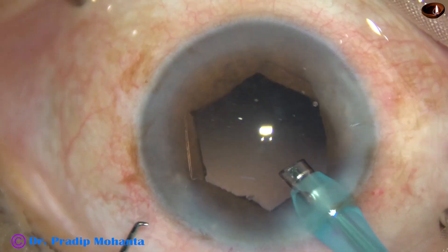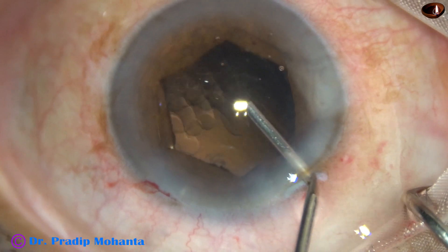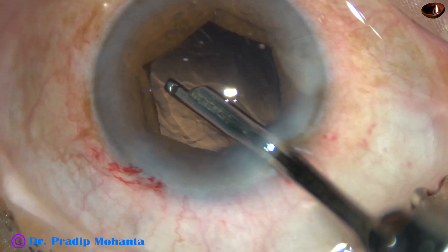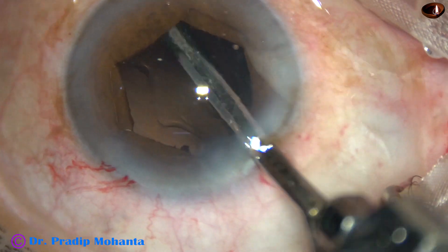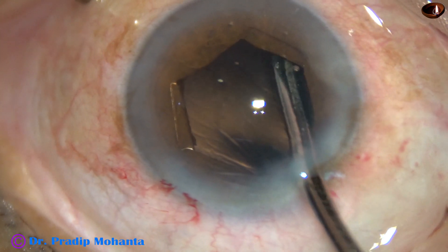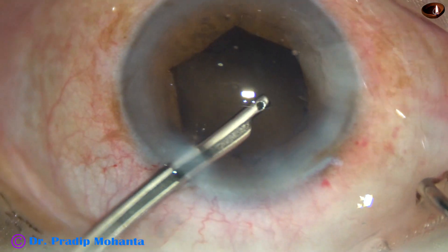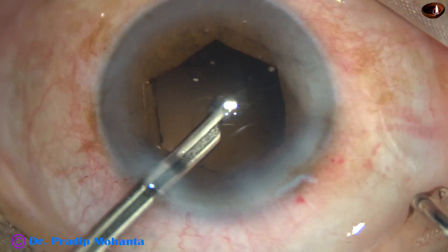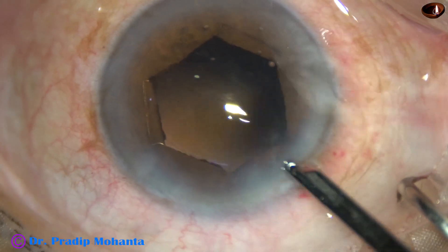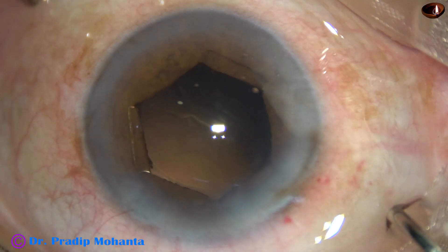The size of this side port is 1.6 millimeter. The cortex is being removed with the help of a Simcoe cannula. Because there is only one side port, I cannot use bimanual. The cortex is coming very nicely. I go through the side port and remove the cortex from 10 o'clock. Cortical cleanup is done nicely. Posterior capsule is cleared — there are no lens epithelial cells sticking to the posterior capsule.